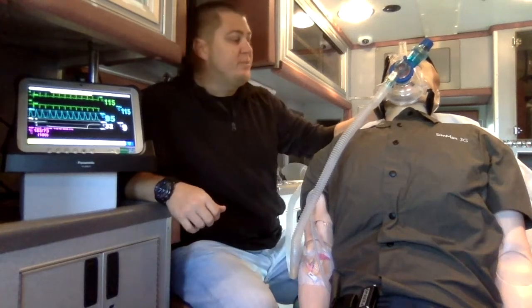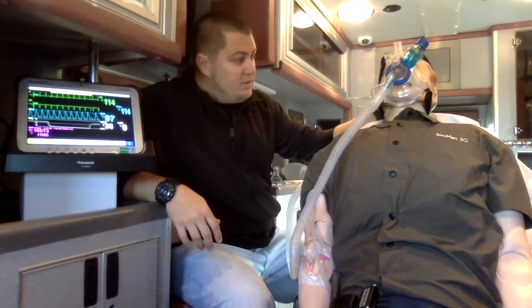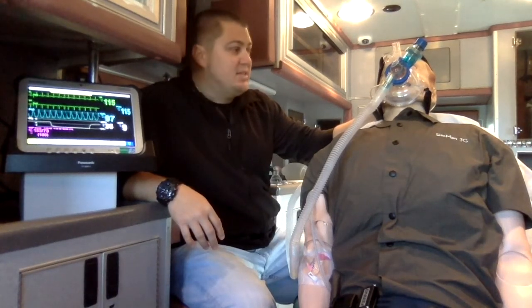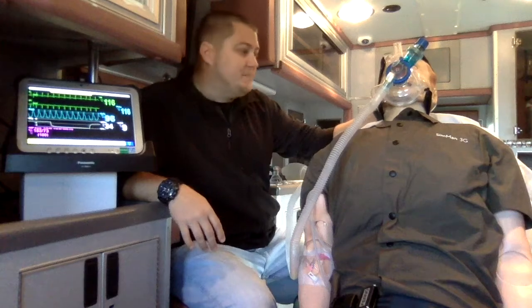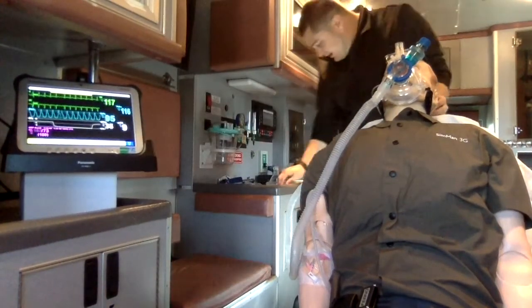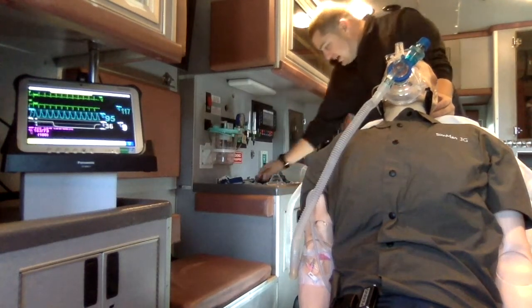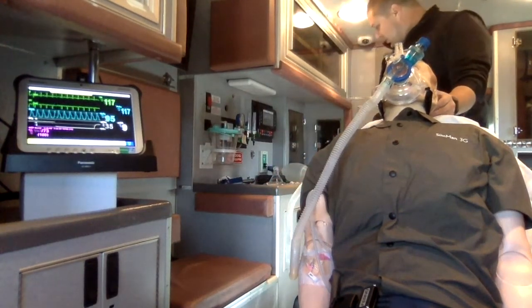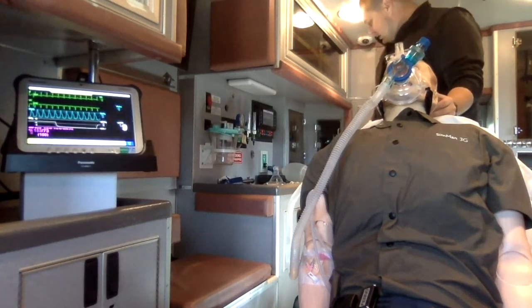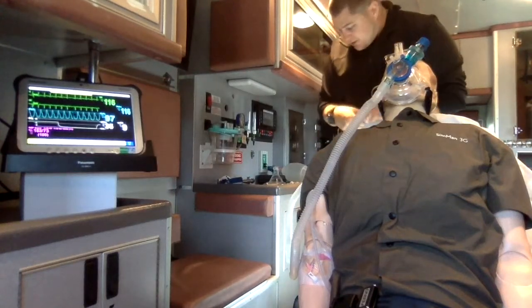So I had an improvement in oxygenation from the initial step, performing pre-oxygenation prior to the intubation step, which is what the ultimate goal is going to be. So I got everything prepared. I got my tube prepared. I got a direct blade, number 3 straight. I have end tidal prepared. I have a tube holder. I have my backup airway. I have King Vision available. I have everything that I need. Suction is also available.